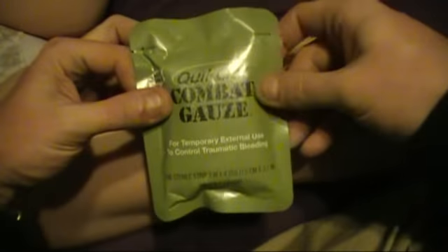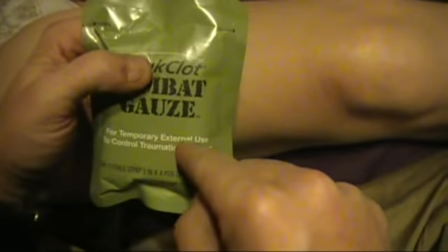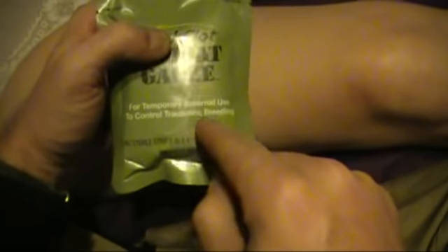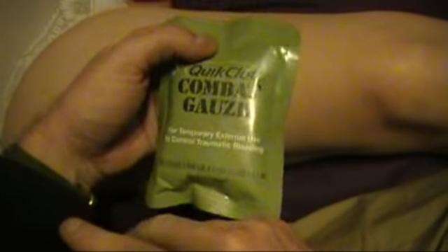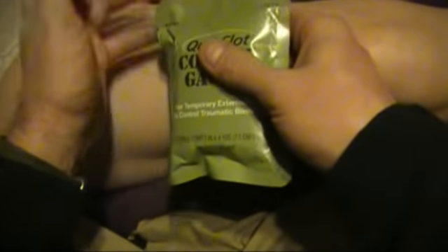Now, the biggest question I was getting is about hemostatic agents. Like this. This is QuikClot Combat Gauze, for temporary external use to control traumatic bleeding. Not paper cuts. Not scrapes and boo-boos. If there's a huge amount of blood, then you can consider using this. Road rash is not treated with QuikClot or anything like that.